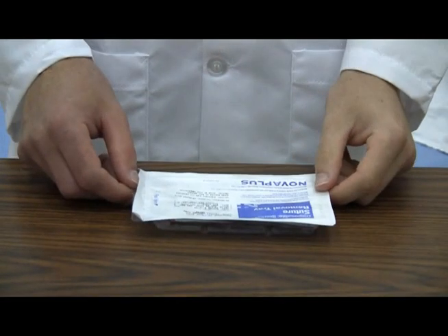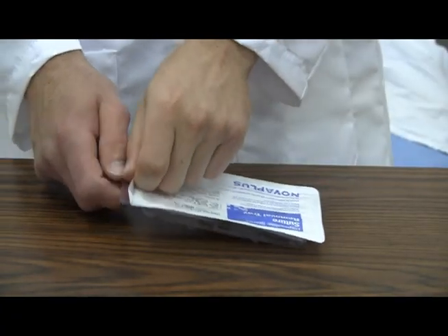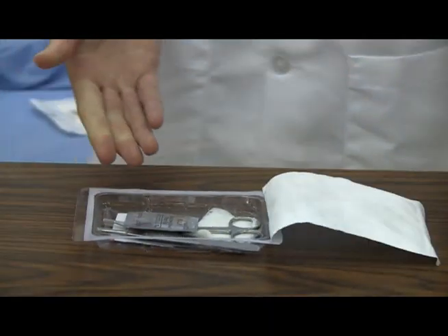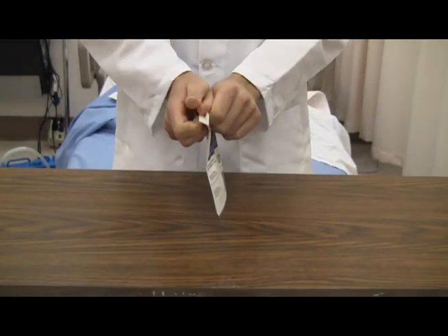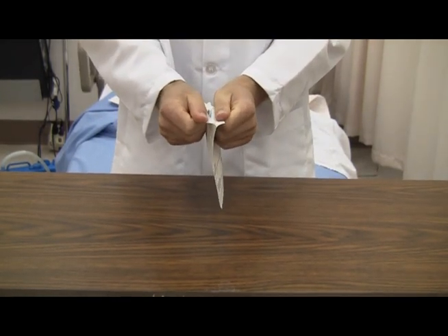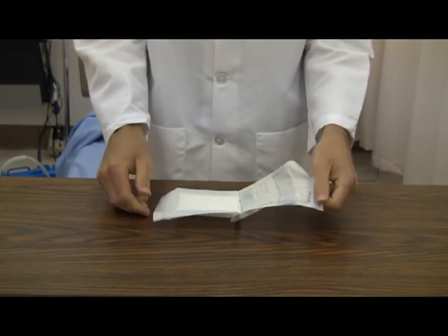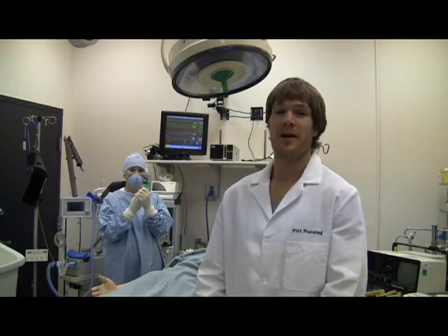Now you don't always have to use a towel to create a sterile field. For example, when I open this suture removal tray, the tray itself will become my sterile field. Another example is when I open my 4x4s. If I open them properly, the package will become the sterile field. Like so. A few things to remember: never reach over a sterile field and don't turn your back on your sterile field. There's lots of different places that you're going to use sterile technique, from the operating room to the bedside.